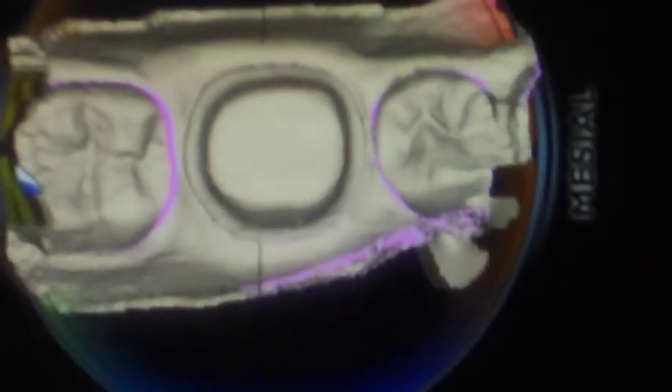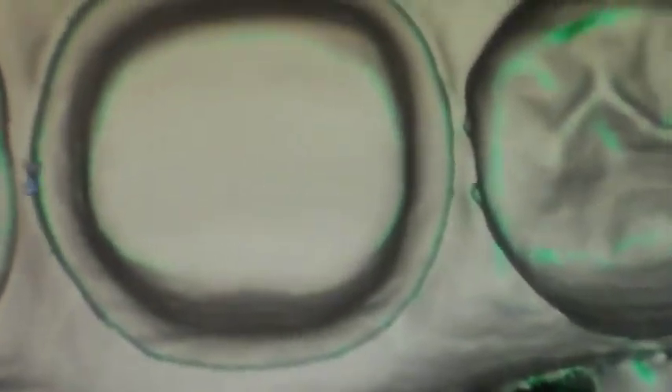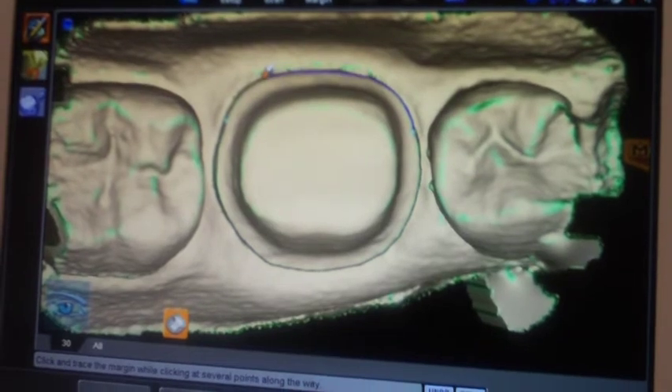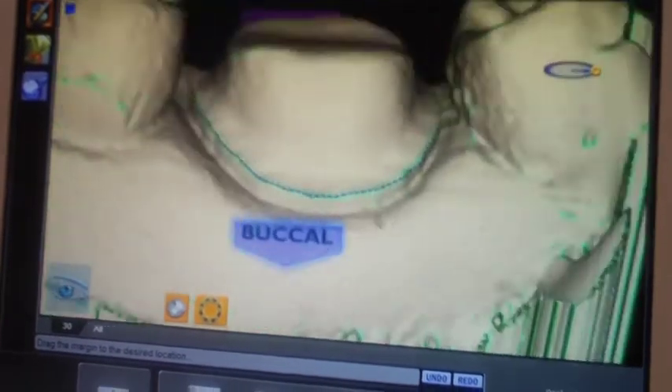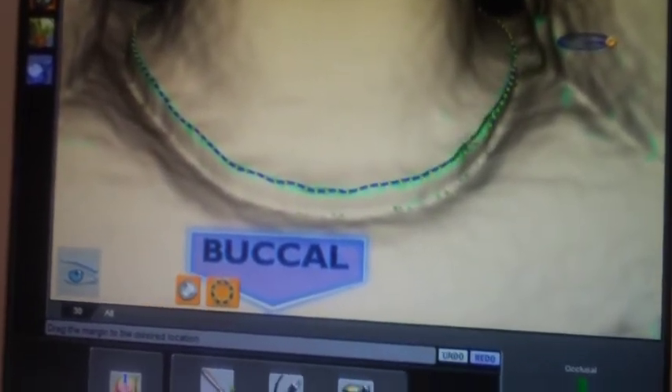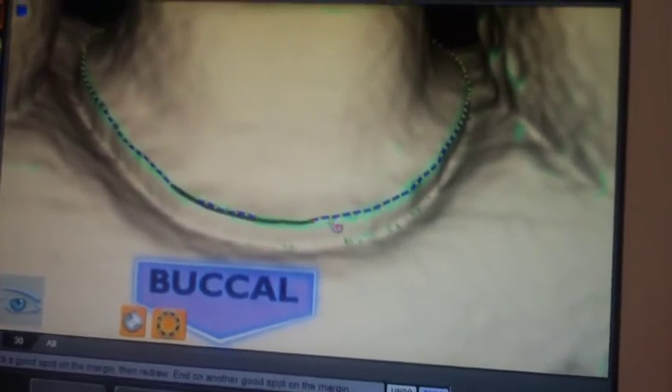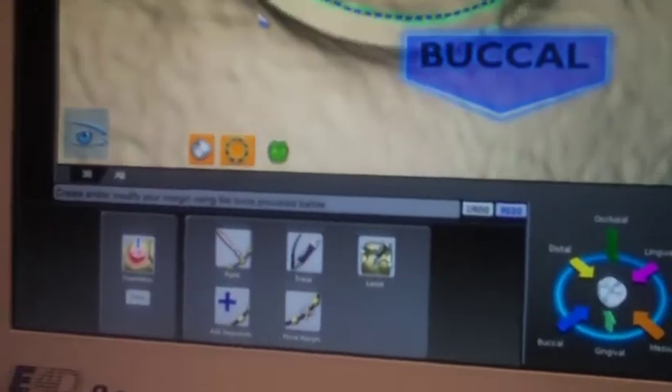Once we have the virtual model built, we go on to the margin function. It allows me to set the model so I have my proper path of insertion, and I want to get this red line parallel to the occlusal table. Once I have it there I click my orientation and it locks it in. I have two automatic margin finders — the lasso, which you probably saw with CEREC, and a paint one. You just highlight it and the system automatically finds the margin. Then I can move it around, assess it, and correct any margins with click and drag. It fixes it up nice and tidy.